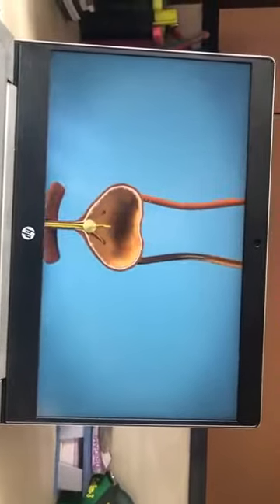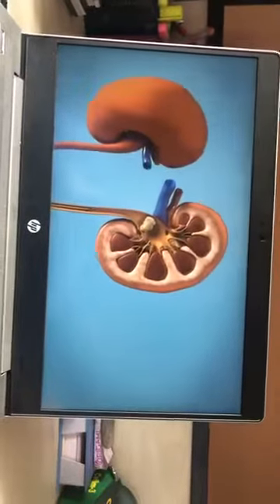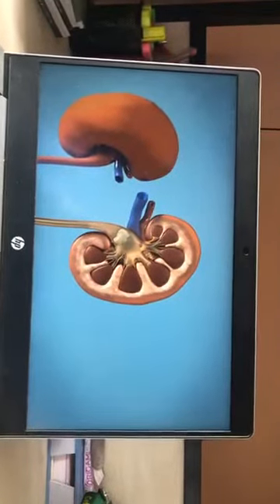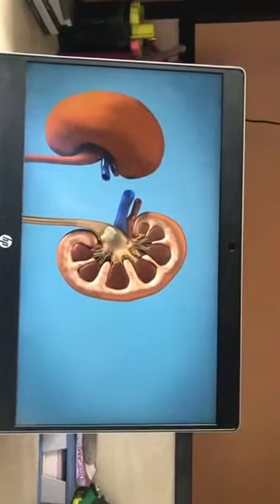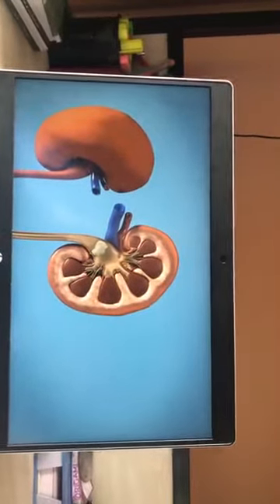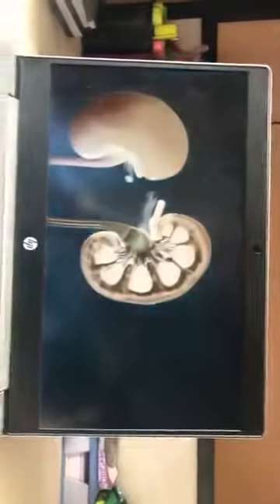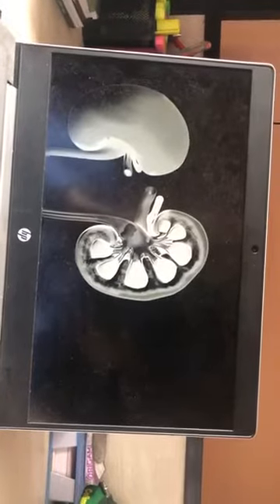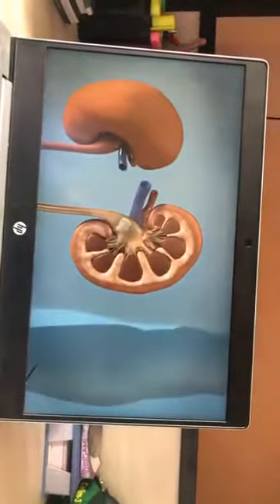So put a ureteric catheter through the ureter, go up to the pelvis. Whenever you do the PCNL from the exterior, they make some water pressure from outside through the ureteric catheter, so the pelvis and calyces are more distended and you can easily puncture and enter the calyces. For that reason, that ureteric catheter is pushed there.